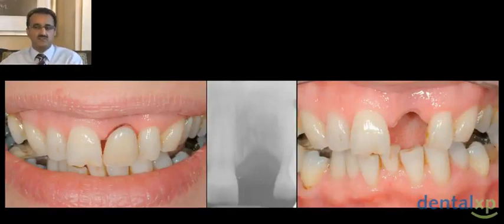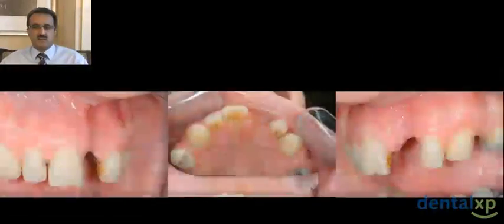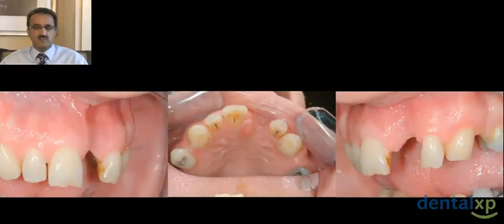You can see that the patient has not the best dentition, and we have some problems that we have to look at. It's a situation where the patient was referred to us after having lost a tooth, which was previously a post-crown with an endodontic failure and I think a root fracture. The patient, unfortunately, was prescribed a number of courses of antibiotics before the tooth was extracted, and so there was some considerable damage to be expected to the bone as the infection was allowed to progress.